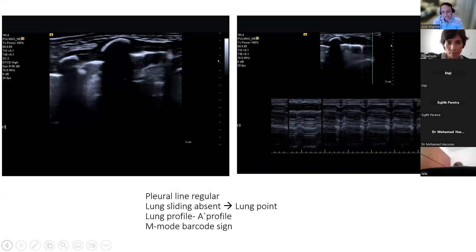I think the beauty of this is, my only comment is, fluid in the fissure, again, slightly favors TTN. Clinical course, again, but you have had surfactant. So a 50-50 kind of a mix. Again, if I think of the incidence of RDS in established labor, it would be less. So either of you could be right, but I'd probably go with really bad TTN in this case, based on the clinical profile and presentation. So lovely. That's really good.